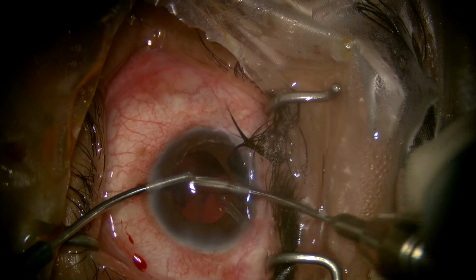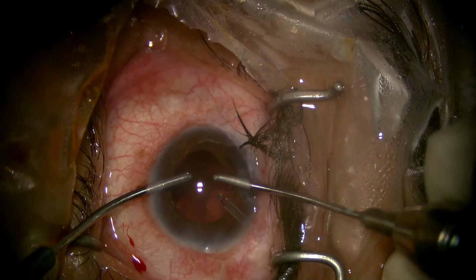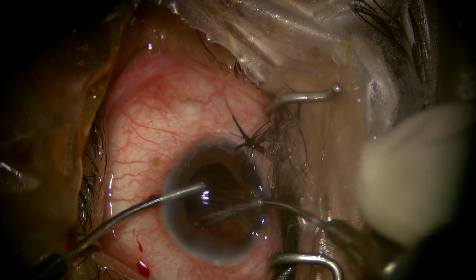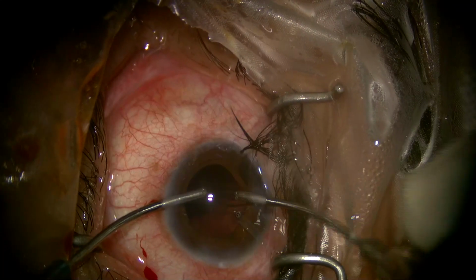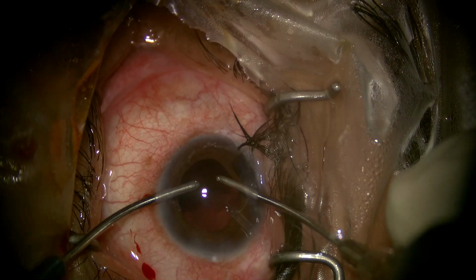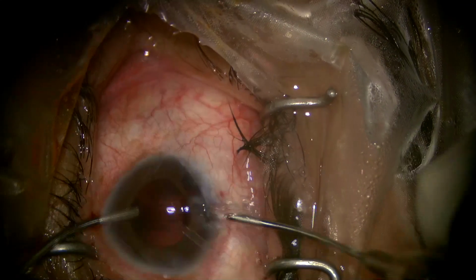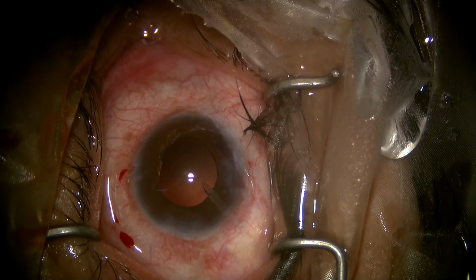after completing the irrigation aspiration of the cortex, the clue is to keep the irrigation in the anterior chamber and do these steps in slow motion so that we do not touch the AGV tube, or we should have a controlled removal of the nucleus or the cortex, because we don't want any fragment floating into the AGV tube.